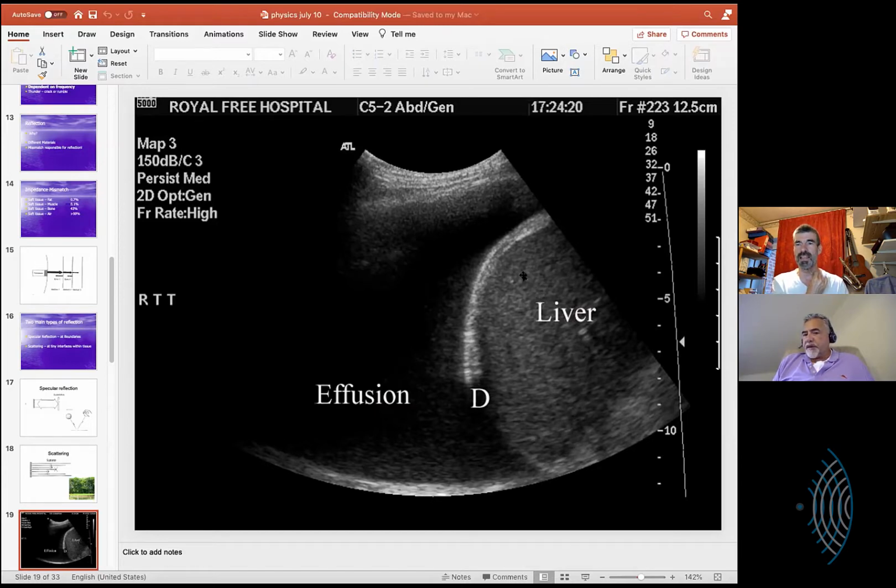You're turning up the gain, which again you said is a post-processing event. It would be like turning up the brightness, because you didn't let me use contrast the last time. Yeah, turning up the brightness. It's like turning up the volume on your stereo. Okay. You are just saying any noise there, I just want to make it louder. And that's what you do.